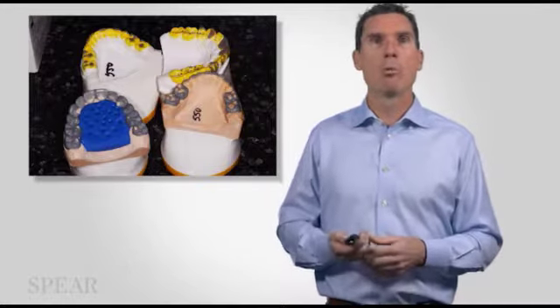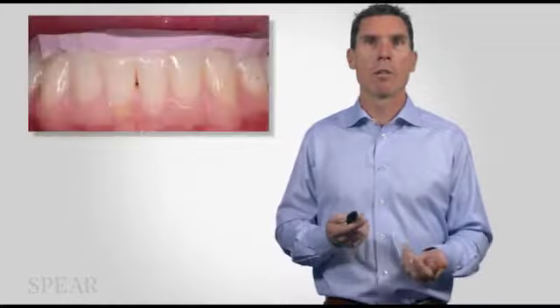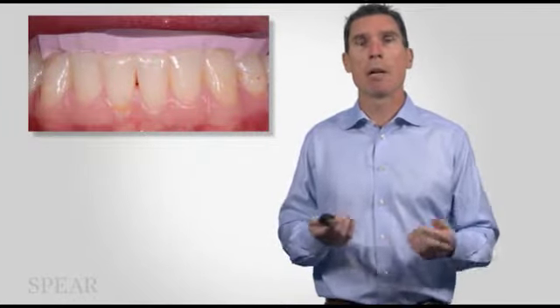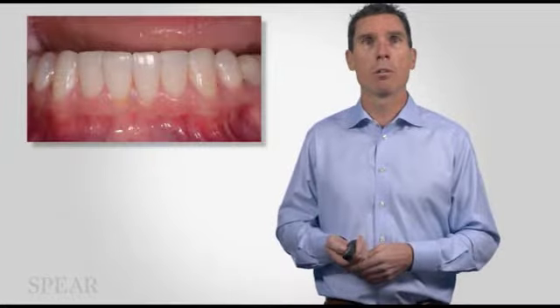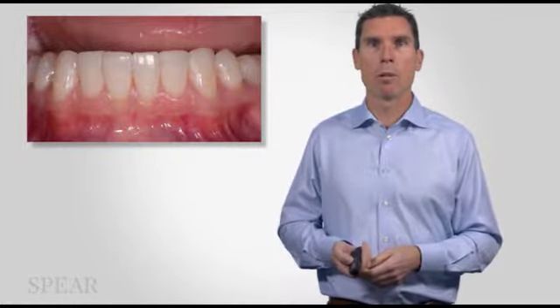Well, we had our blueprint. We can use the blueprint in a lot of different ways. For me, what I did is I started with the lower incisors and the structure was composite. It made most sense. So I had a little putty based off of the wax up that I could use, and I could real quickly just do those front 6, and actually ended up being about 7 teeth to get a cusp tip on one of the premolars in through there.